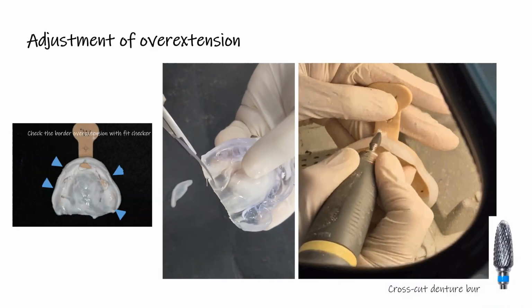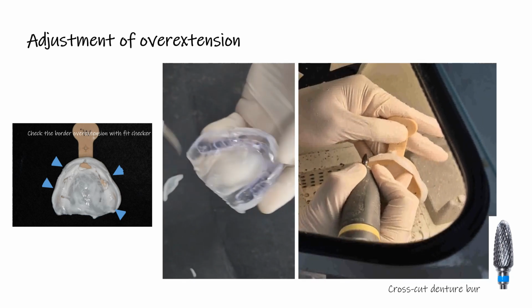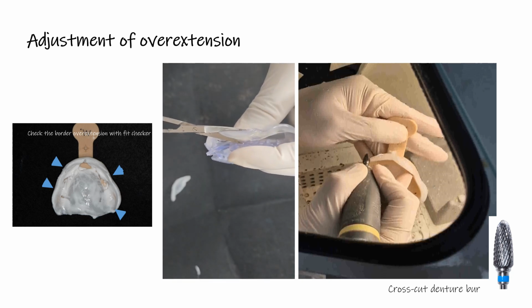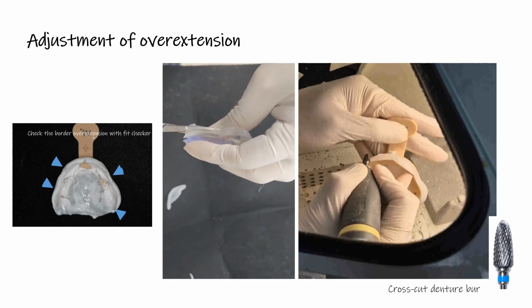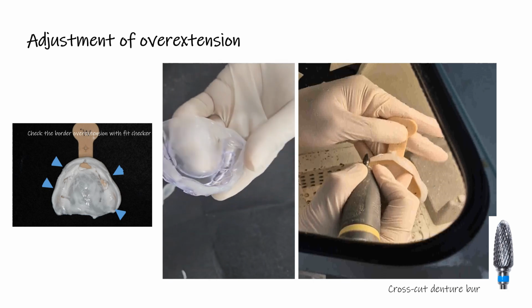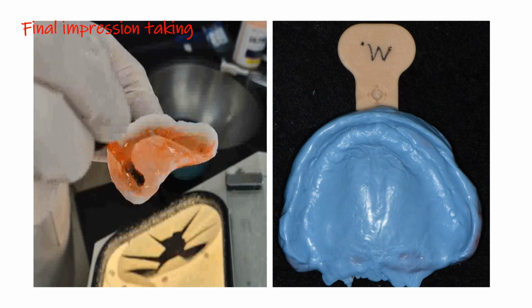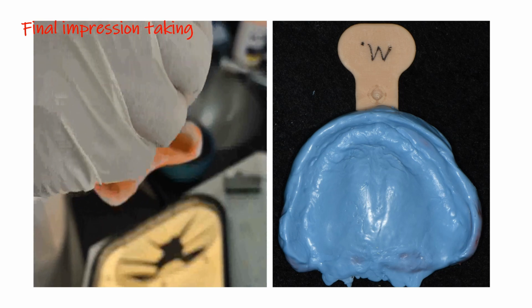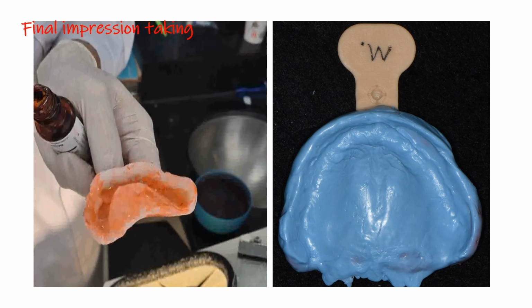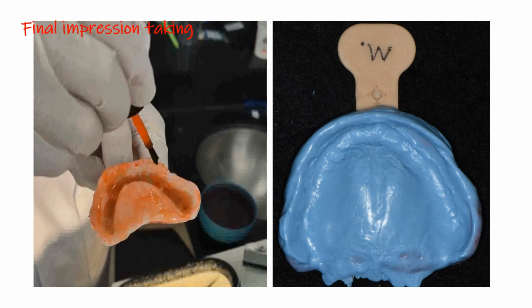If any areas appear too thick or extended, use scissors or a cross-cut denture bur to trim them to fit. To capture the final impression, apply a silicone adhesive, then use silicone impression material, and you can take the impression using the normal method of final impression.